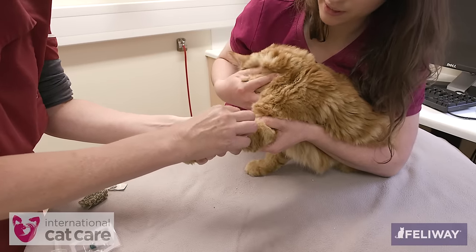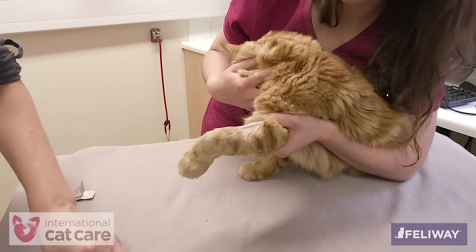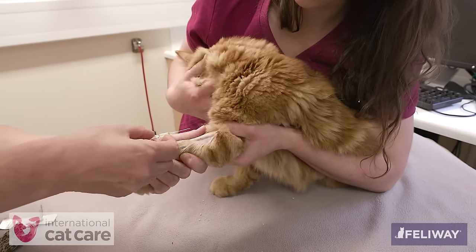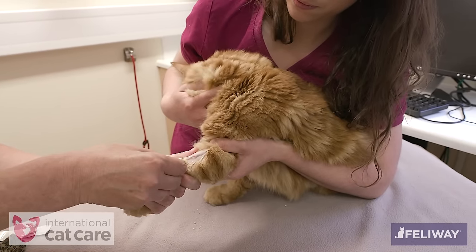Here, the assistant uses her left arm to tuck the cat into her body and also extend the elbow and raise the cephalic vein. The assistant strokes the cat's head throughout the procedure. She allows the cat to hide its head in her arm.